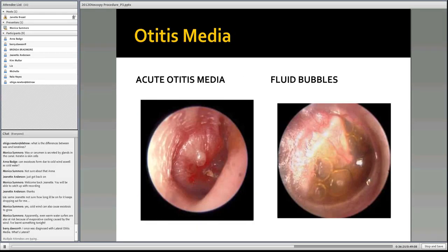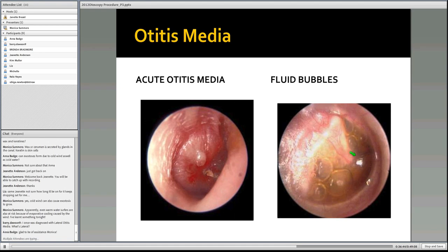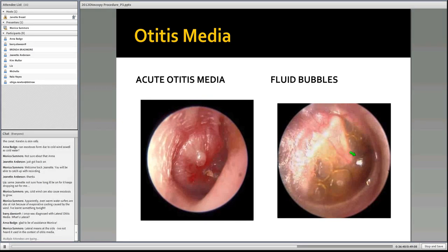So here's some lovely pictures of otitis media. We've got a nice little redness. No, you cannot see your landmarks at all. You've got the eardrum pushing forward. This one here, you can see yellow bubbles. We've got a nice little yellowy kind of pussy infection forming here, so it's not very pretty. When you look down an ear and you see that, you know it's abnormal. You don't have to diagnose what's going on, you just need to know when something doesn't look right.